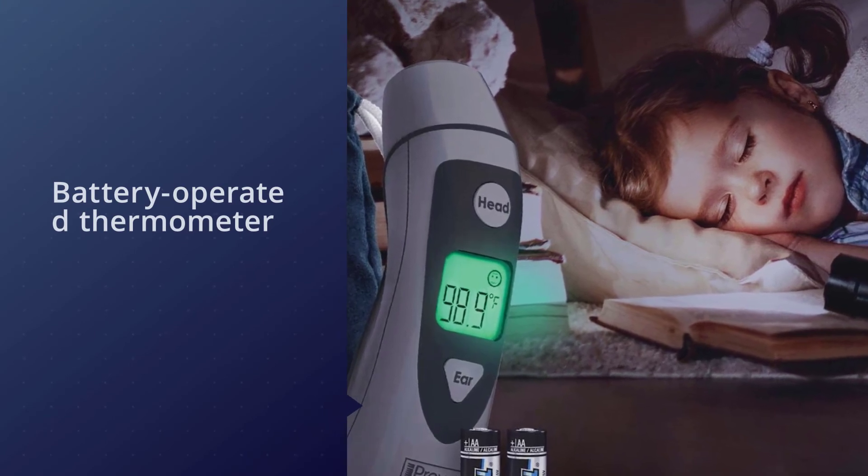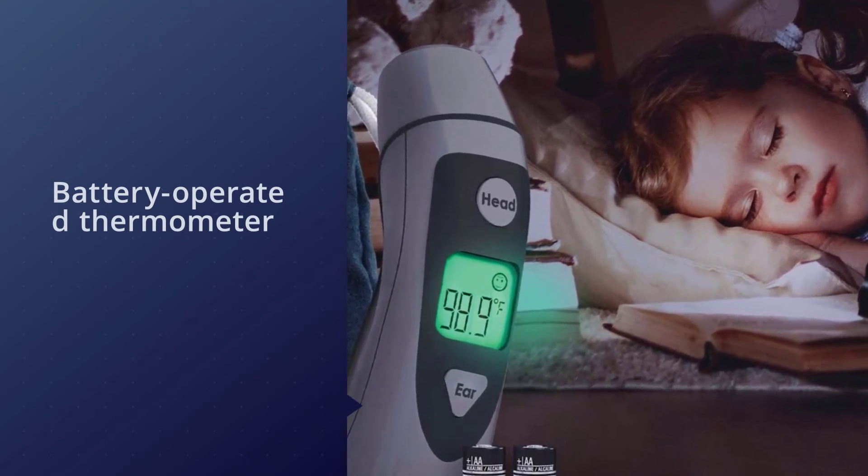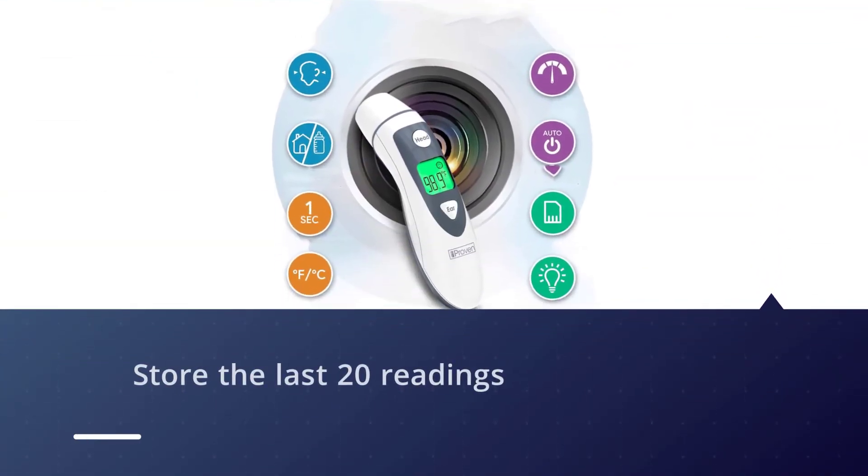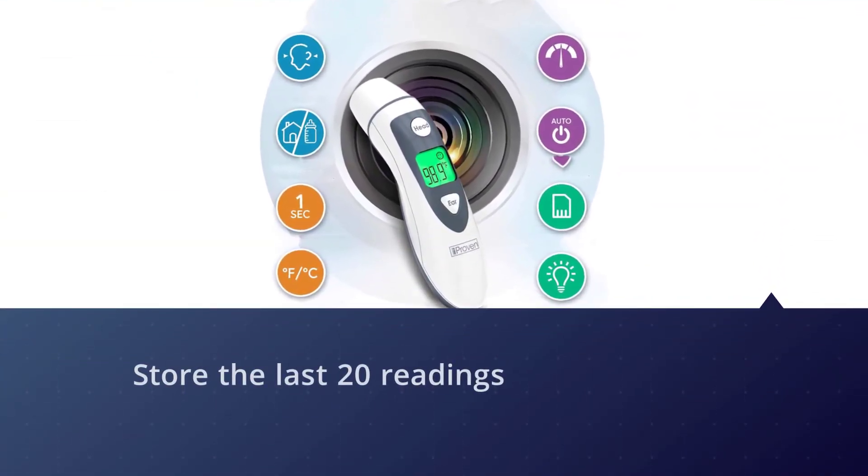Already a popular pick with more than 3,600 perfect reviews, the battery-operated thermometer can even store the last 20 readings and comes with a handy carrying bag.